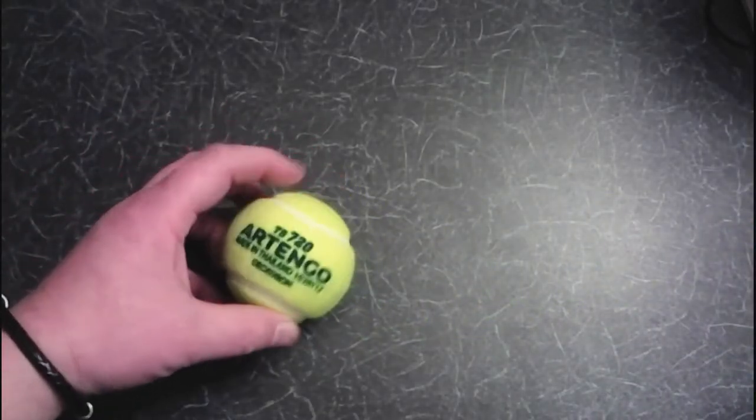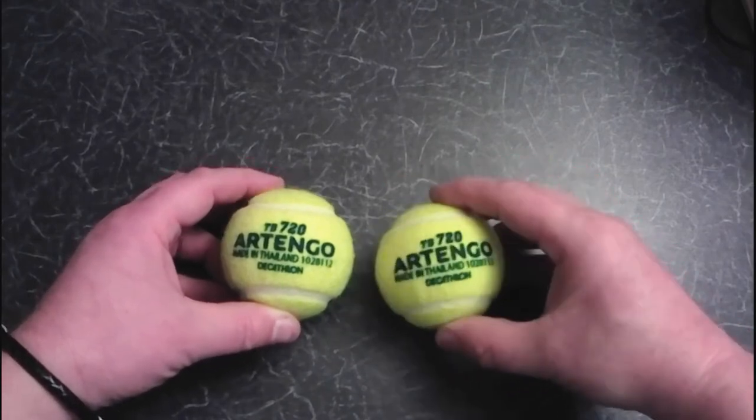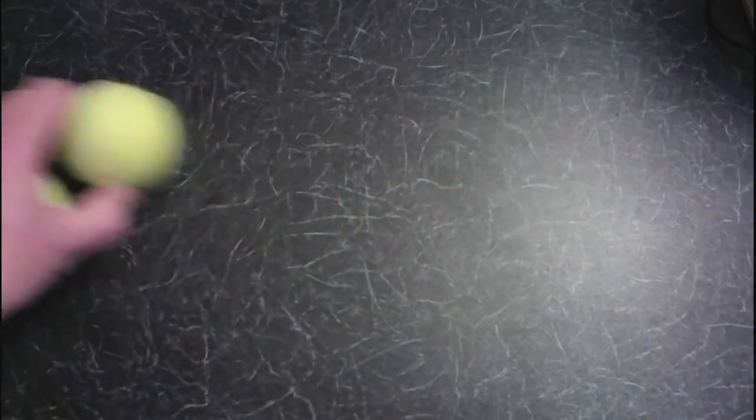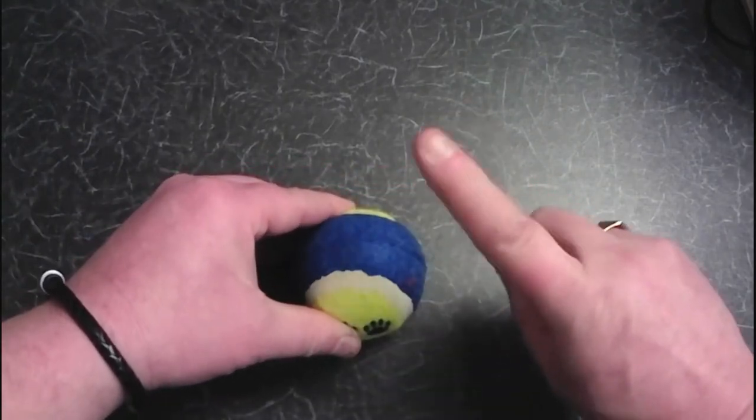You will need two tennis balls. Make sure these are good quality, proper tennis balls — we want them to be squishy so that they feel very similar to a pedal in a car. Don't be tempted to use a cheap ball intended as a dog toy; it does not feel the same. You will also need three cable ties and an old sock.